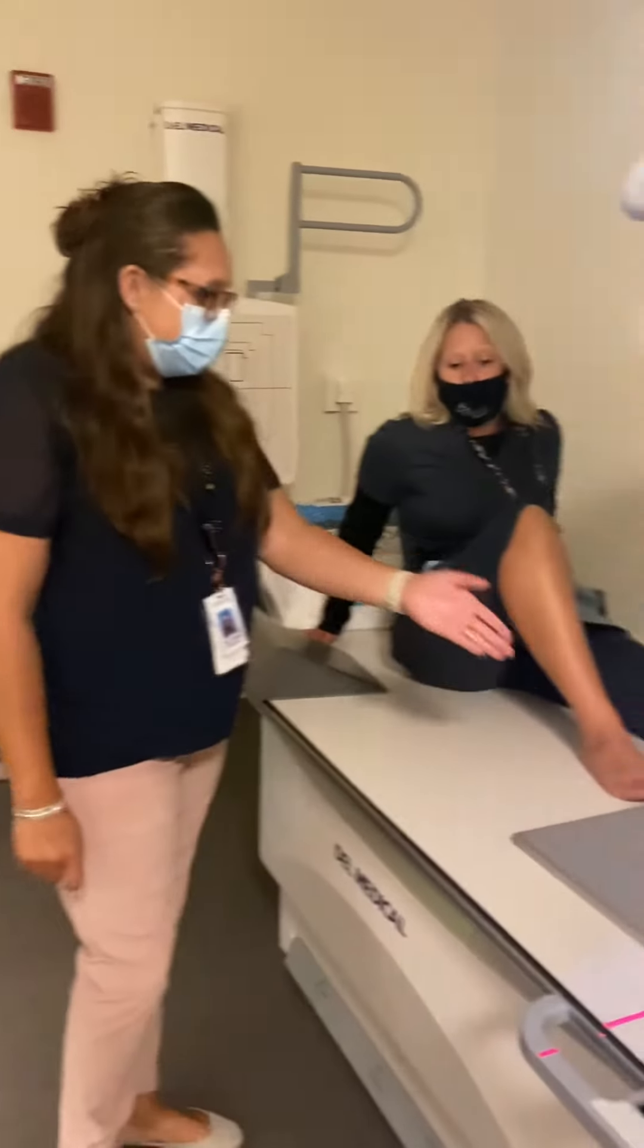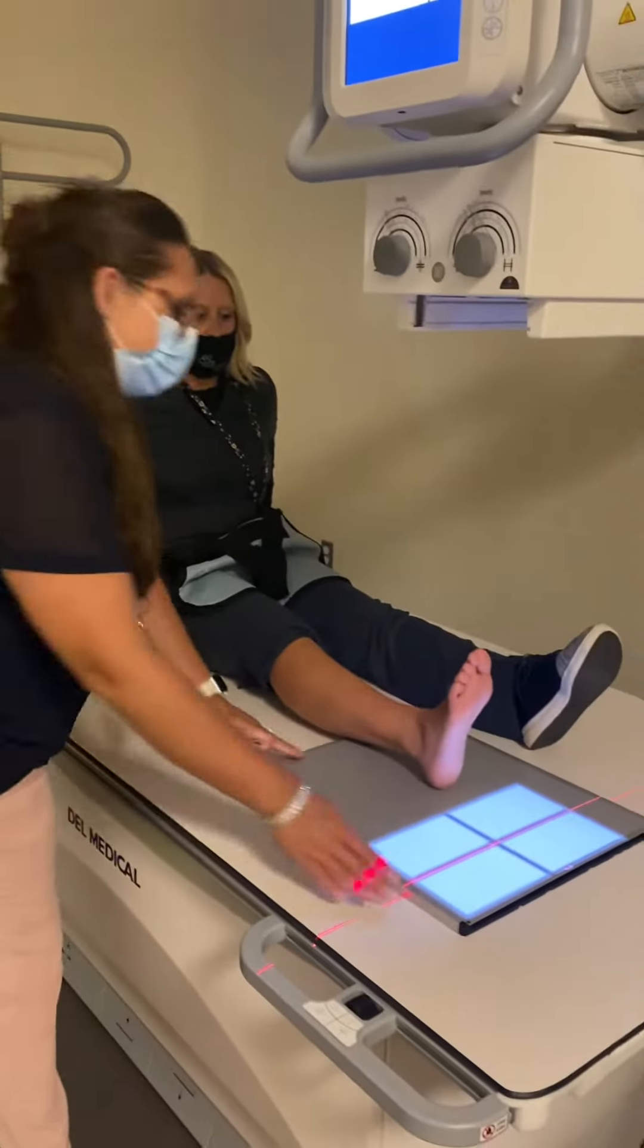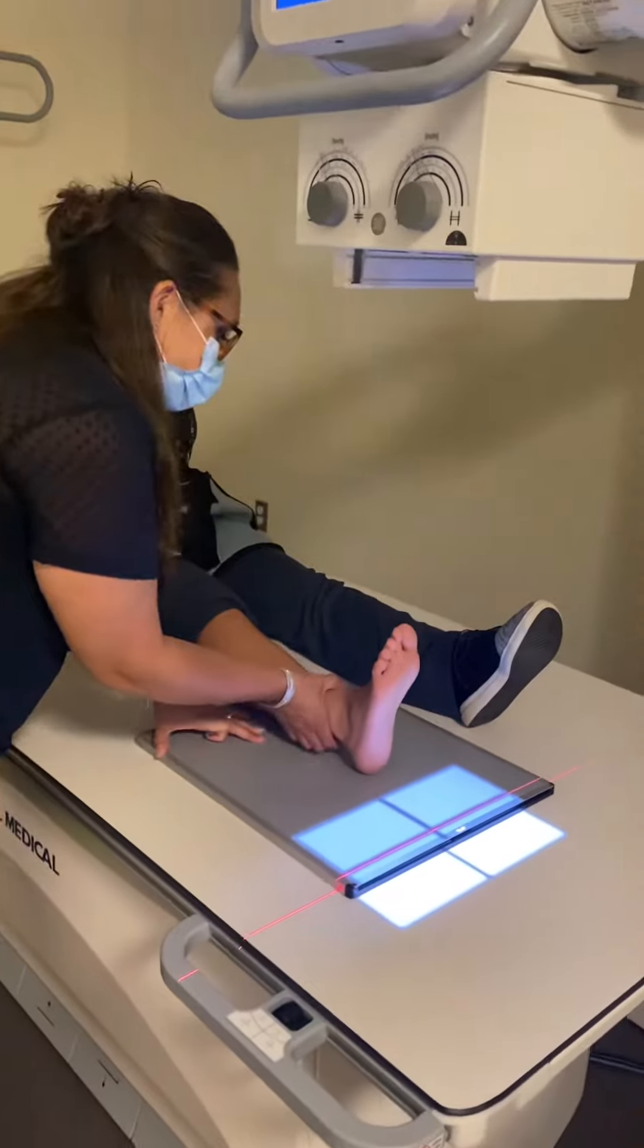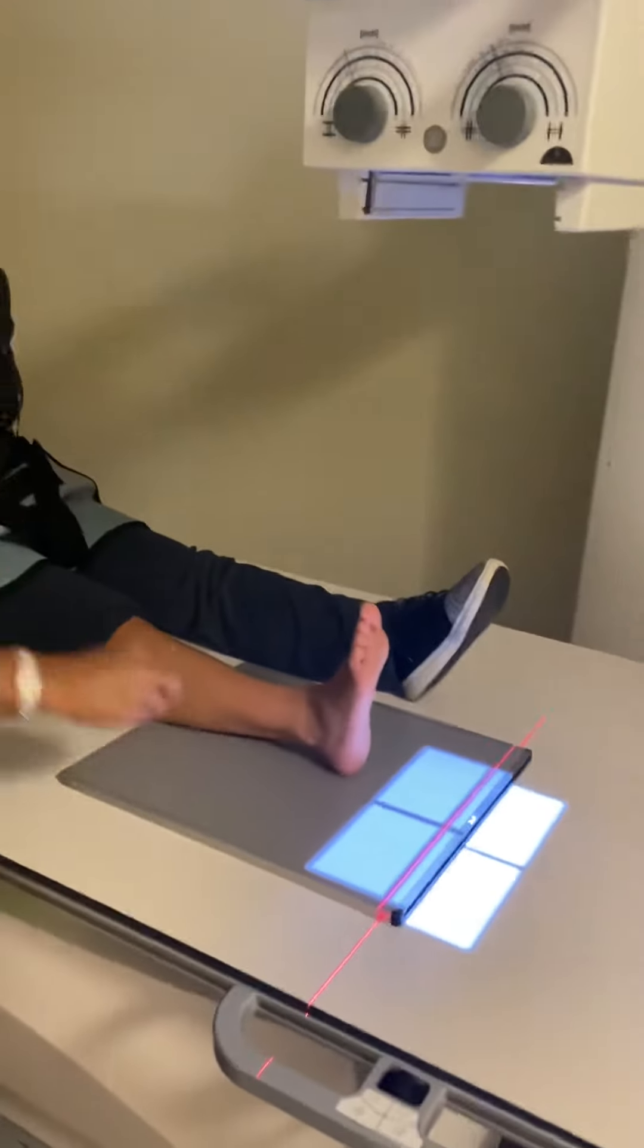So for the ankle, you're going to have your patient point their toes straight up at the ceiling, center their ankle right in the middle of your IR, still a 40-inch SID.